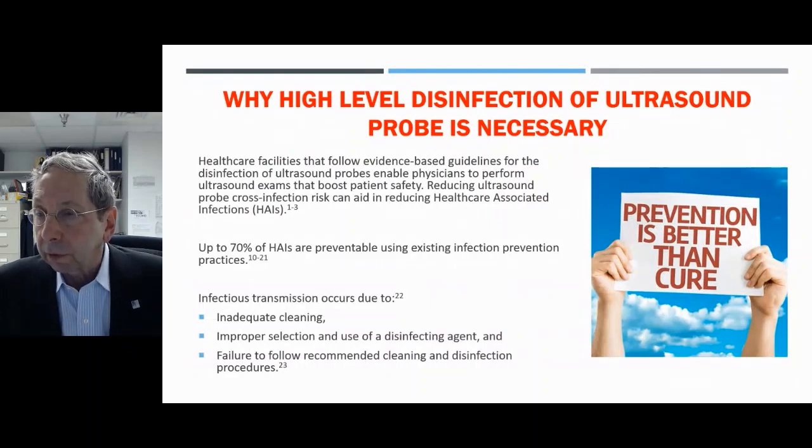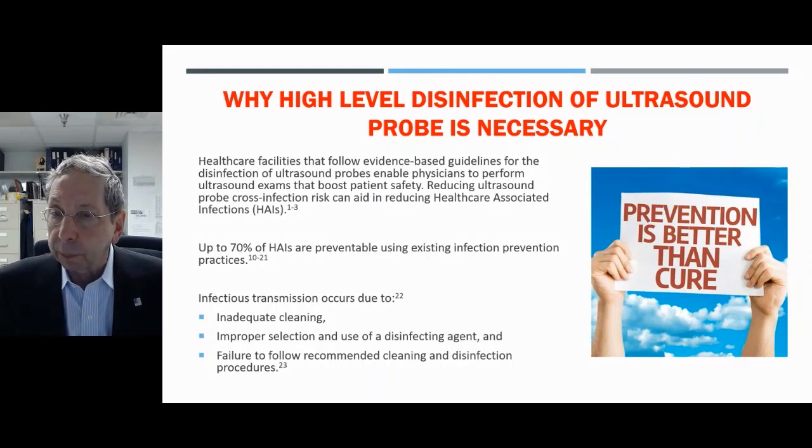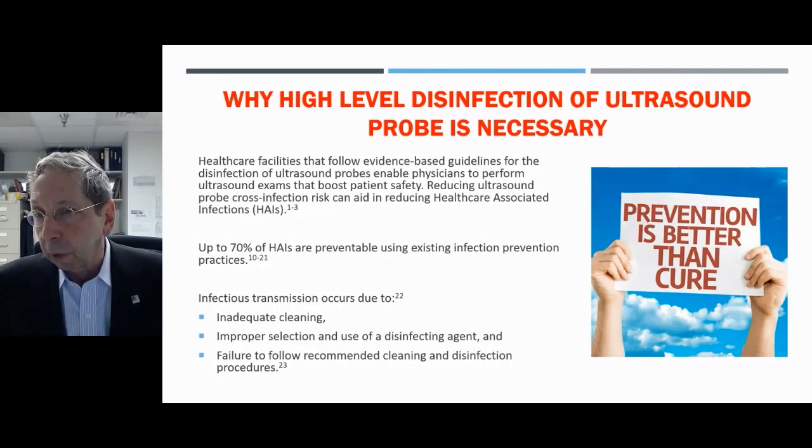So why is high-level disinfection of an ultrasound probe necessary? As with this issue, but with everything we do in healthcare, prevention is always better than treatment or cure. And so healthcare facilities should follow evidence-based guidelines that mitigate risk with the use of ultrasound probes. Up to 70% of healthcare-associated infections are preventable using these existing infection control and prevention guidelines.